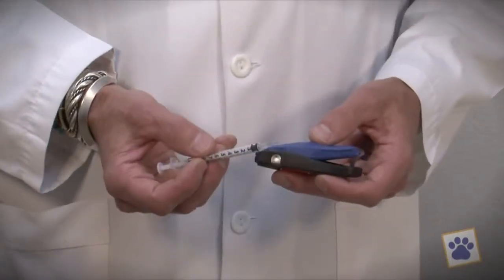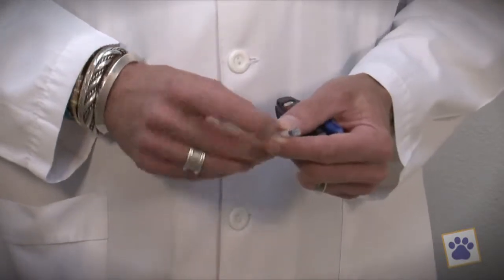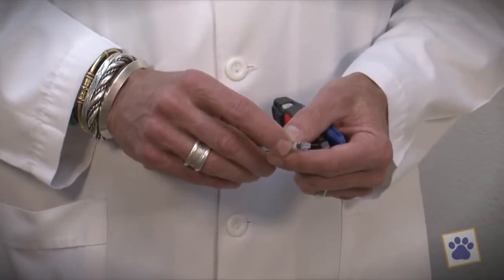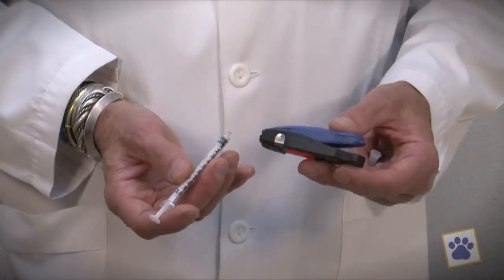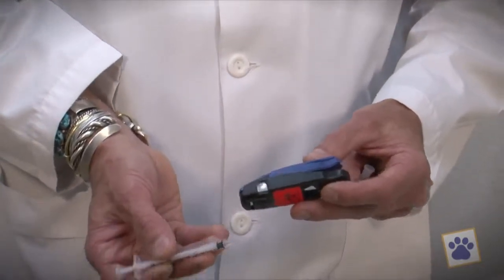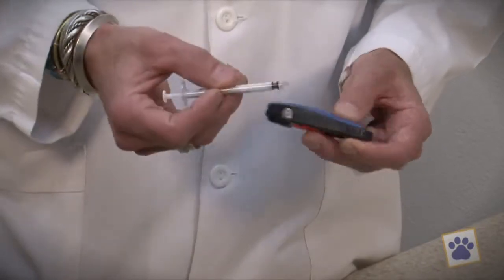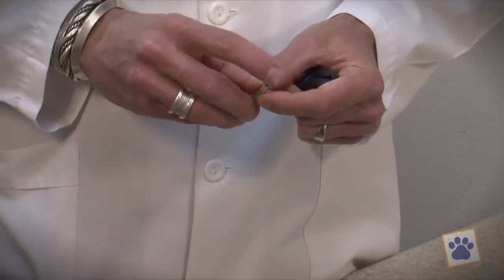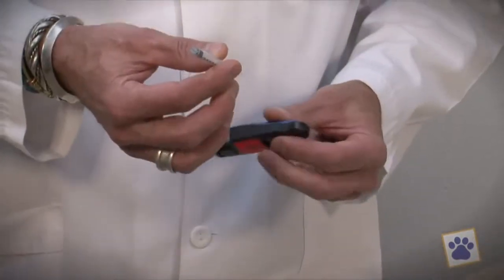The final step to this process is properly disposing of our sharps. We can't just throw these needles into the garbage because they're a hazard to the garbage workers and other people in the family that may reach into the garbage, so I recommend using these BD needle clips. Take the needle, insert it into the opening, squeeze down, and it has now snapped that needle off. There's no danger to this anymore, and this piece can be thrown away.